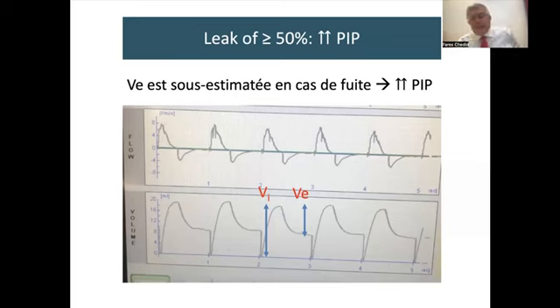There is, in all volume guarantee modes in every ventilator, what's called leak compensation. So if there are 10, 20, 30%, up to 40, some say 50% leak, there will be compensation for that, and the machine would know that there was a leak. It will adjust to it, and the PIP will not shoot up. But whenever the leak exceeds 50%, I will take out the volume guarantee because I would think that the leak compensation might not be totally correct. So a heavy leak could increase the PIP. This is the message.